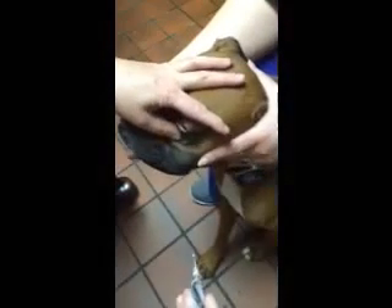There are several safety techniques we're going to use to prevent from damaging Bailey. I want to take a scrape of the inferior conjunctiva, so I'm going to rest my hands on Bailey — that way, if Bailey lunges into me, she'll push my hands away. The second safety measure: I'm going to take the blade to the inferior conjunctiva and move the blade towards me, away from the eye. Anytime I'm working on the eye, I'm going to be moving away from it.